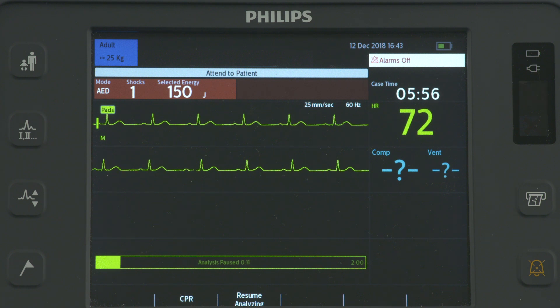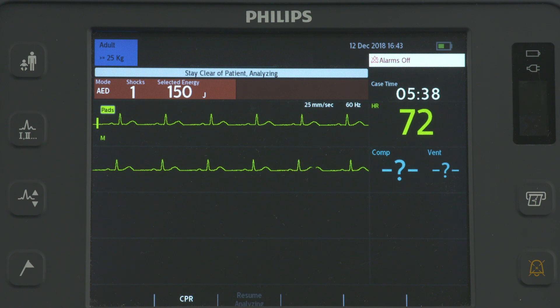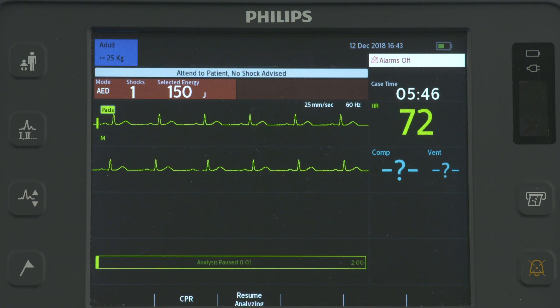The HeartStart Intrepid enters a configured CPR timer period and reanalyzes the ECG when the pause period ends, or you press Resume Analyzing. If a shockable rhythm is not detected, the device tells you "No shock advised," and analysis is suspended during the configurable pause period, at which time you administer CPR.